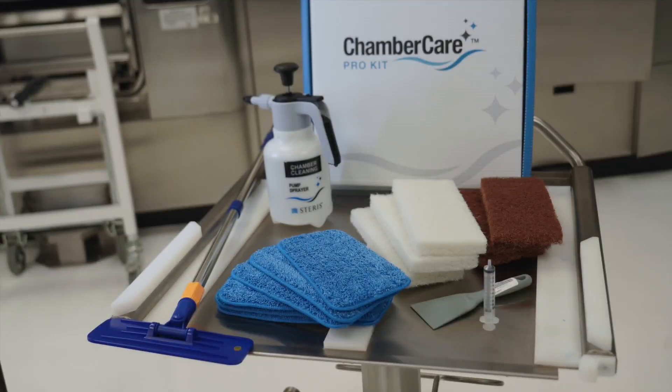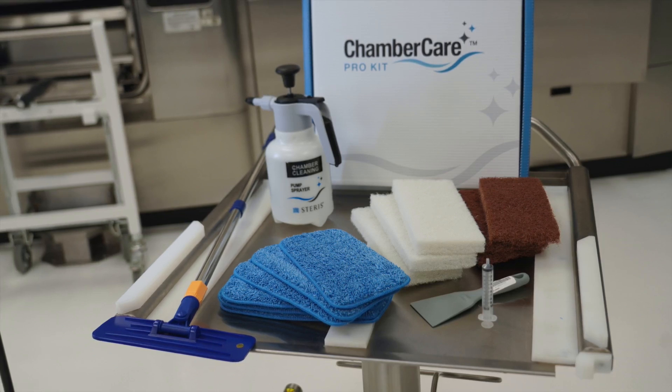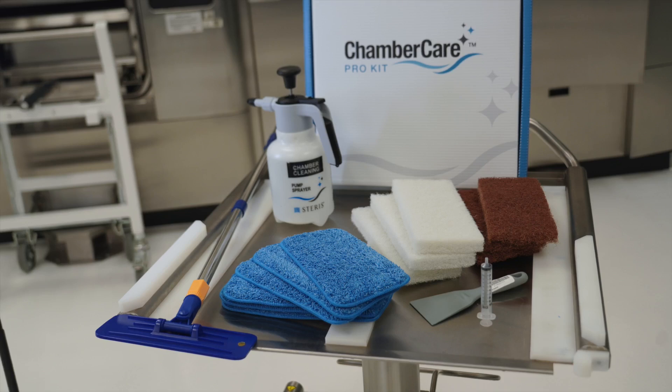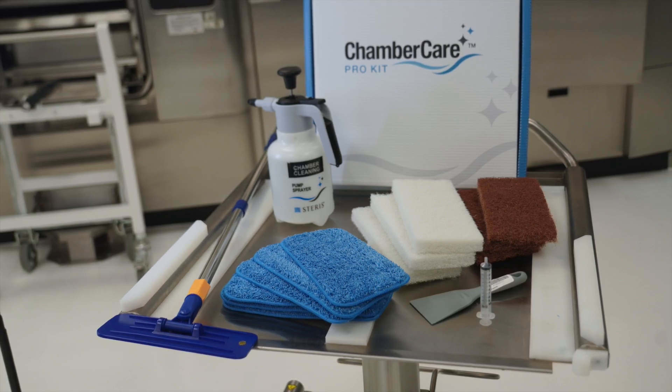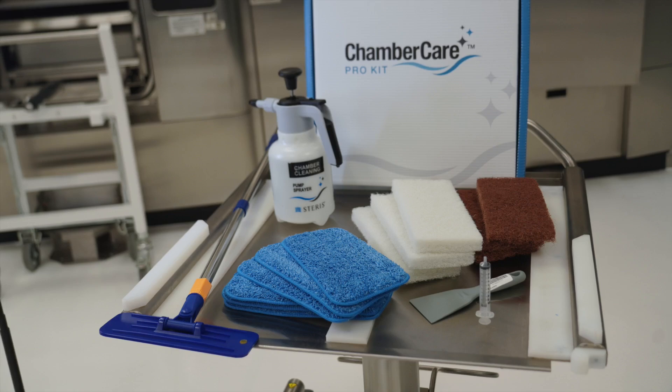or equipment service technician. Kit contents include: chamber cleaning pad and holder kit, chamber cleaning brown heavy duty scrub pad, chamber cleaning white light duty scrub pad, chamber extension pole telescopic, chamber cleaning pump-up sprayer, plastic chamber scraping tool, and chemistry dosing syringe.